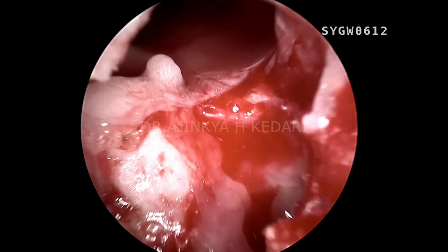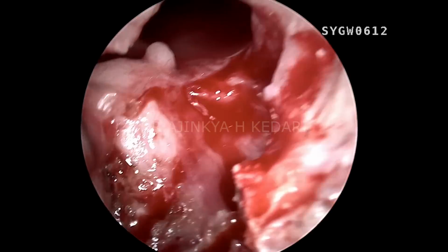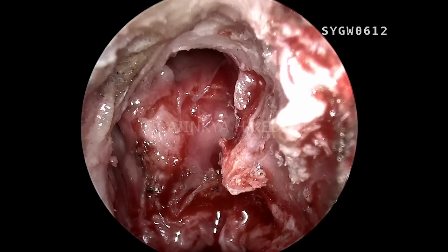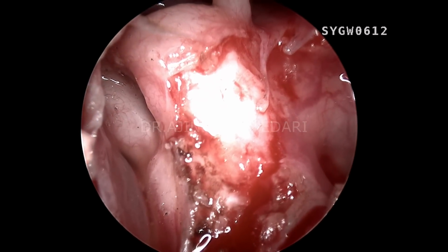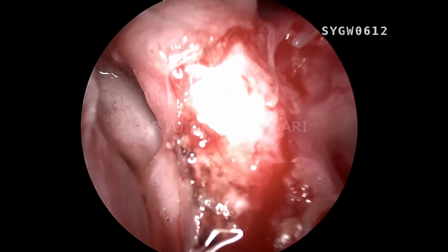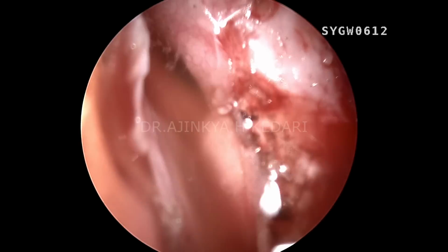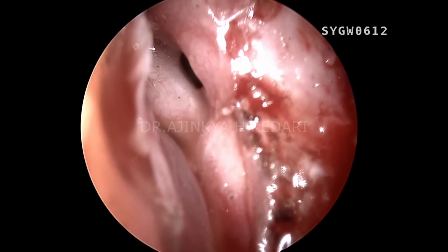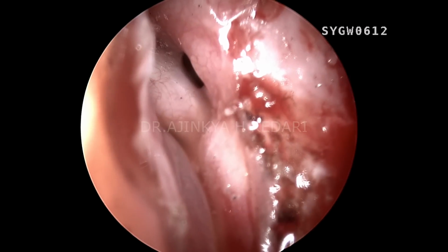And where the CSF leak is happening right now is in the inferior lateral part. So you can see that's the whole superior half of the frontal. So I need to drill more bone from all sides to have more visualization as such. Now, if you can rewind the video, you can see the defect head on, through which the CSF is actually pouring right now with high flow.